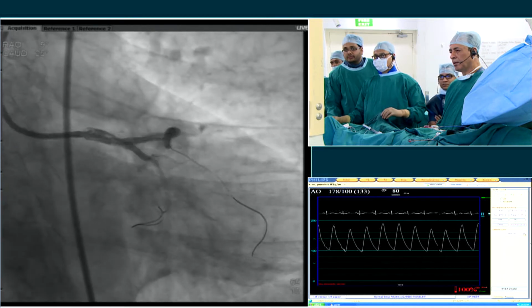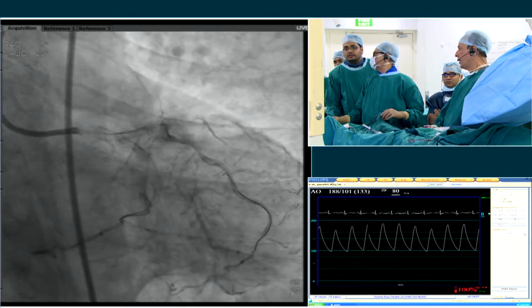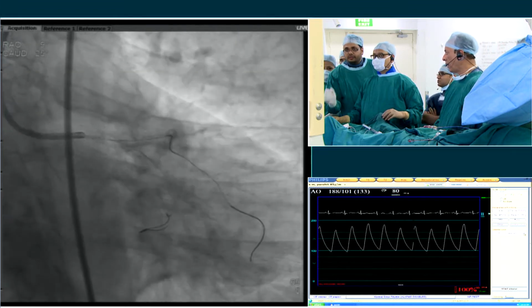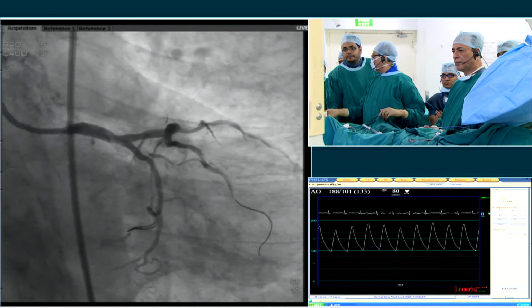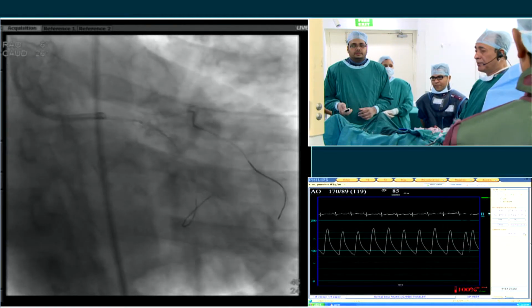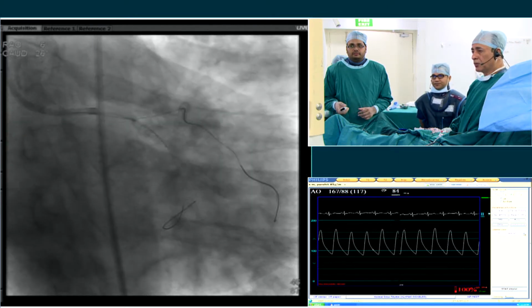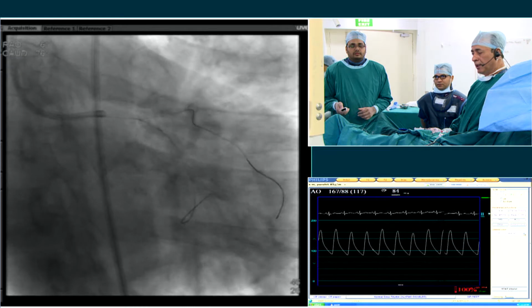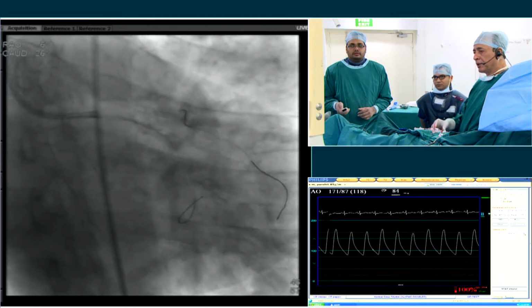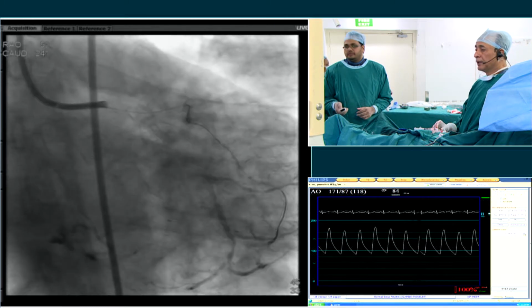So that's a fantastic demonstration. So now what you're going to do is you'll go back and recross and kiss and then image. And what we'll do is we'll go to the lectures, but then we'll come back. I left two where they just saw it. We recrossed again with the two and then dilated. Can you get the images, please? Can you see it?